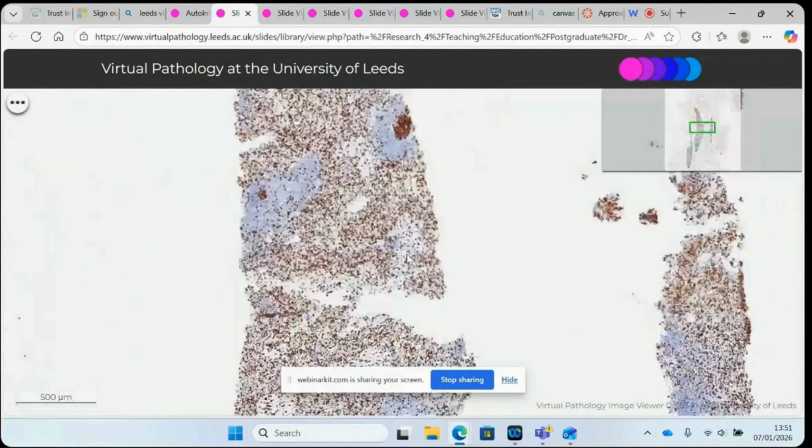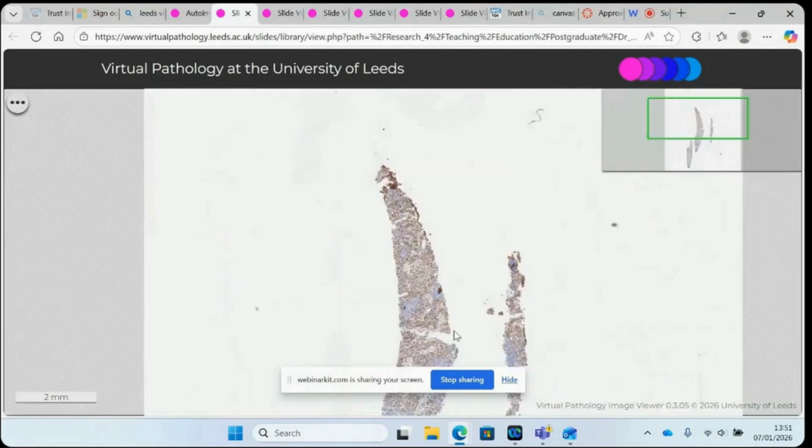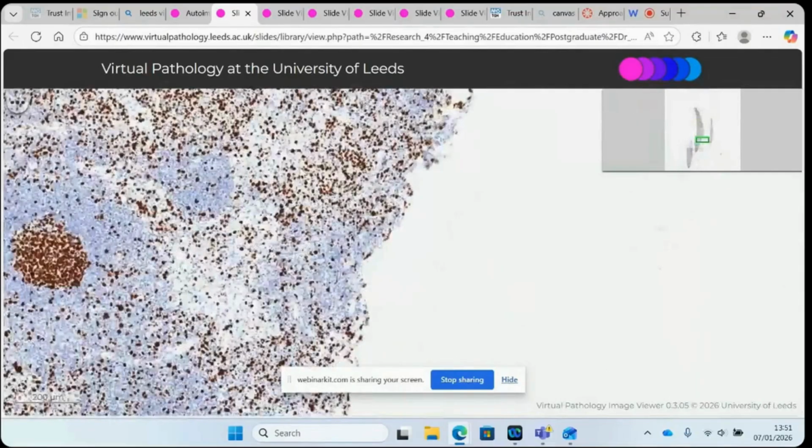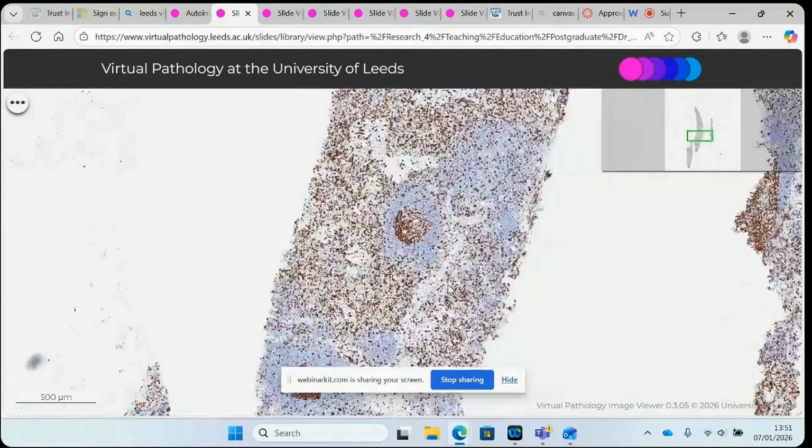So some of them must be quite small and they've just cut tangentially across the more proliferative areas, but in others you still have some polarization. And the Ki67 is low in a neoplastic follicle, because follicular lymphoma is driven by failure of apoptosis rather than increased proliferation.